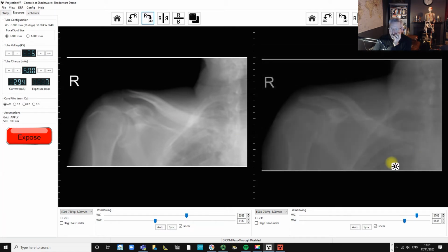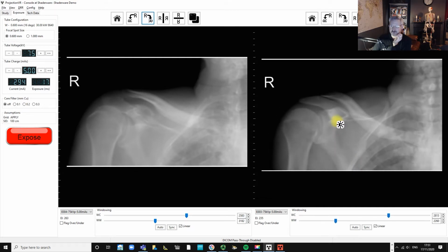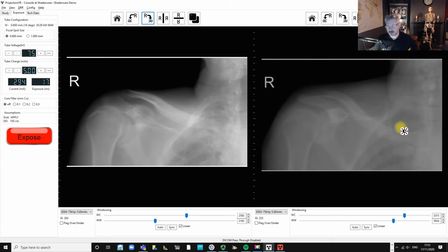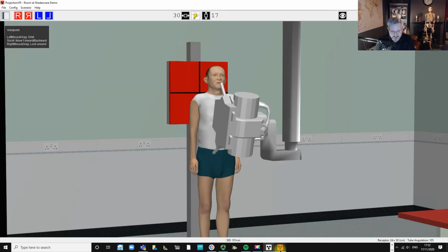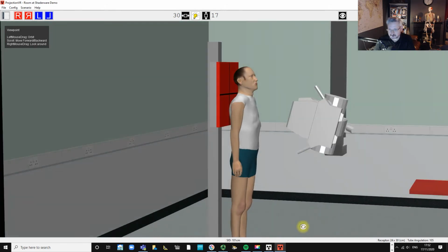Okay, so there are 2 reasonable projections of the clavicle, and they're the ones that are quite commonly referred to in the textbooks. It's still not a great difference in alignment, but it is a difference. You can see there's a gap here. You can see the acromion and the scapula there. Okay, so let's try a larger angle. So the books talk about 15 degrees to 30 degrees as an angle that's applicable. So let's try, that was 15 degrees, let's try 20 degrees.